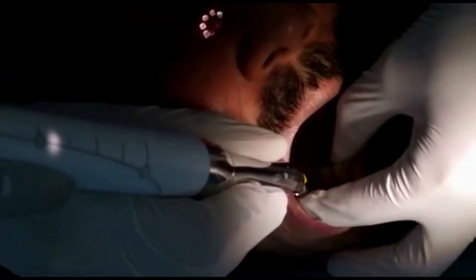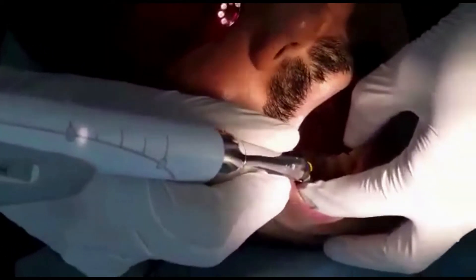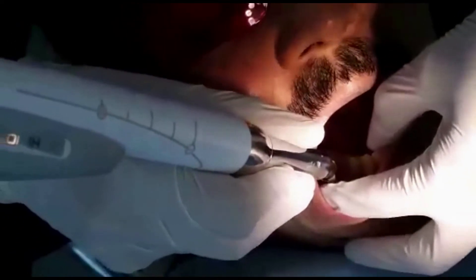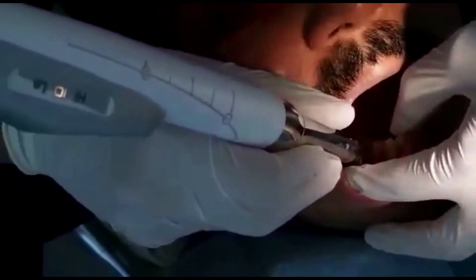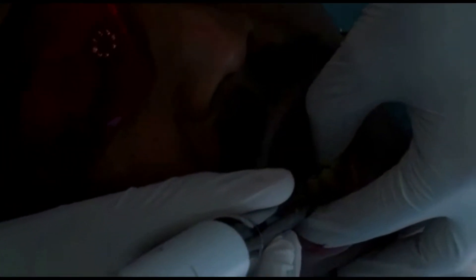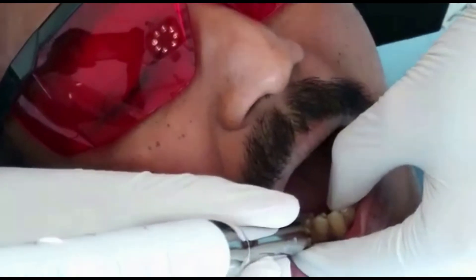No pain? No pain. I will start. The patient will feel a little bit of vibration and sound — don't worry about it. That's it. I'm giving you the anesthetic now. I will tell you if you feel a little complication in your heart, don't worry about it, it's normal, it's nothing. Everything is going to be fine.